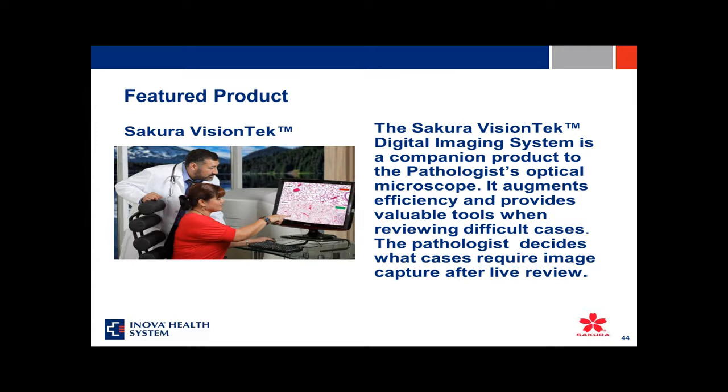Okay, thank you. I think I have the last and final question: how accurate is the digital reading versus the manual reading? Yes, that's a good question, and there are a number of papers within the past year that have published digital reading versus manual reading. Again, it depends on the types of specimens, and your frozen section slides are different from your IHC slides. We validated it for reviewing IHC slides. It could be different for cytology slides, and it really is a difference. As far as IHC slides are concerned, I would say it's almost the same.